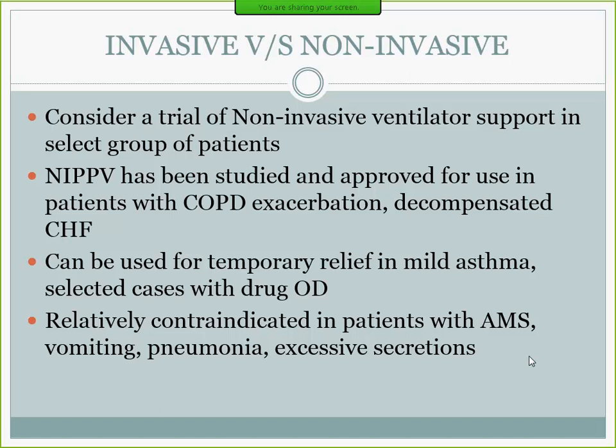Of course, you don't want to use it in pneumonia, and excessive secretions. If you use it in excessive secretions, it is going to block the secretions from coming out, and that's going to make them worse. So in pneumonia and excessive secretions, you want to stay away from using non-invasive ventilation.